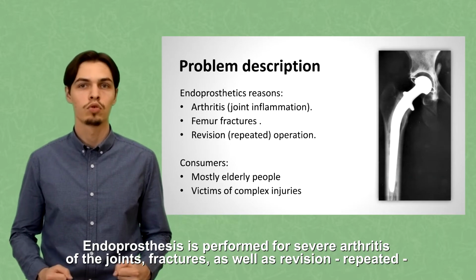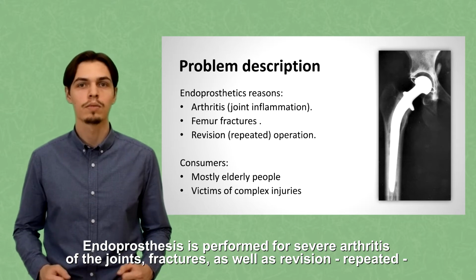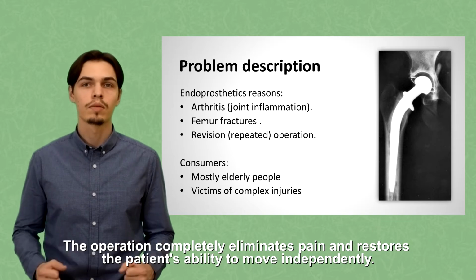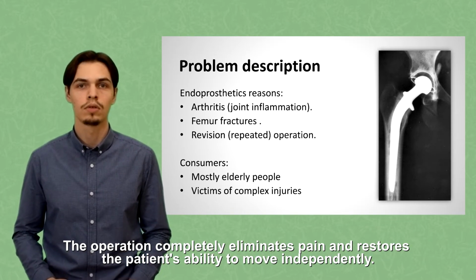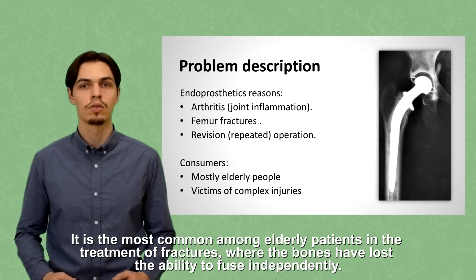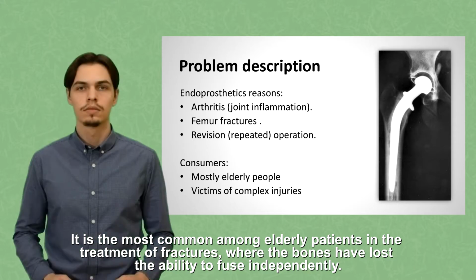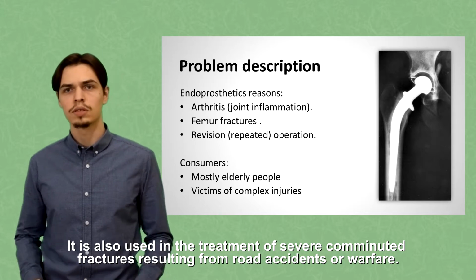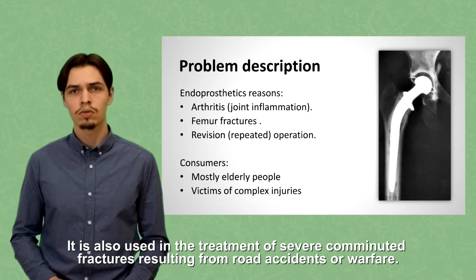Endoprosthesis is performed for severe arthritis of the joints, fractures, as well as revision, repeated operations to replace worn or loose implants. The operation completely eliminates pain and restores the patient's ability to move independently. It is the most common among elderly patients in the treatment of fractures where the bones have lost the ability to fuse independently. It is also used in the treatment of severe comminuted fractures resulting from road accidents or warfare.